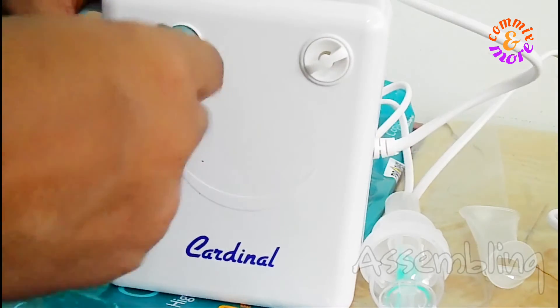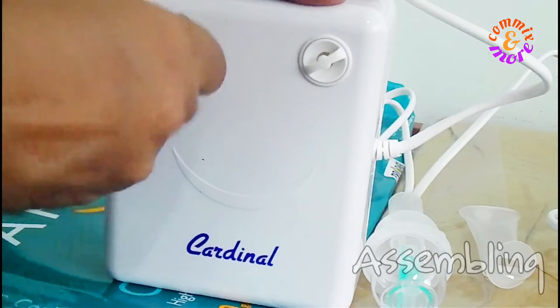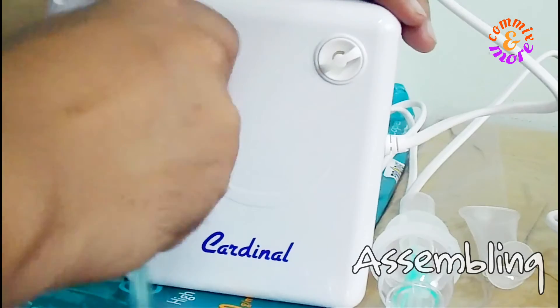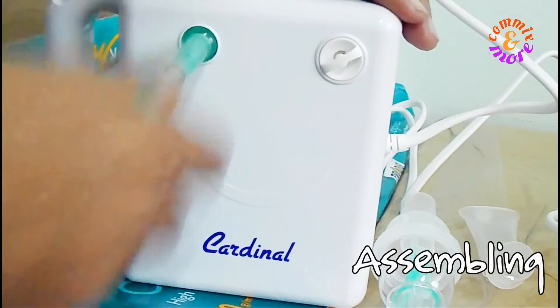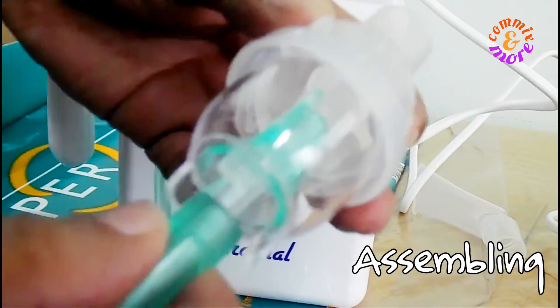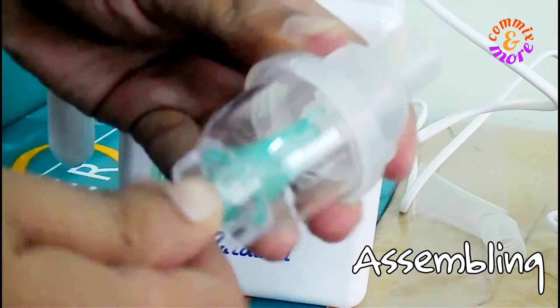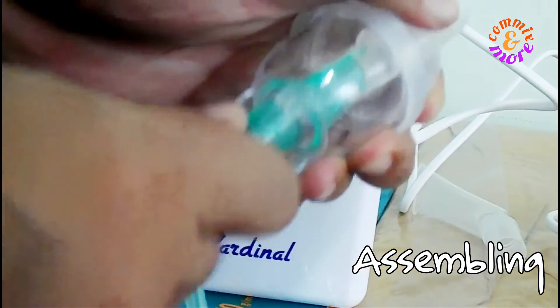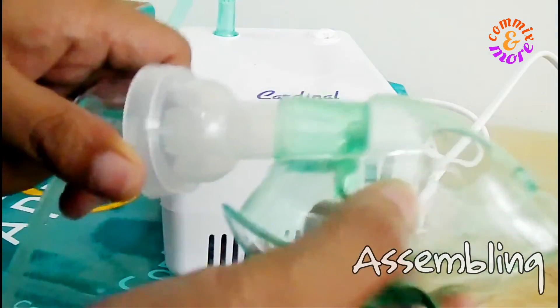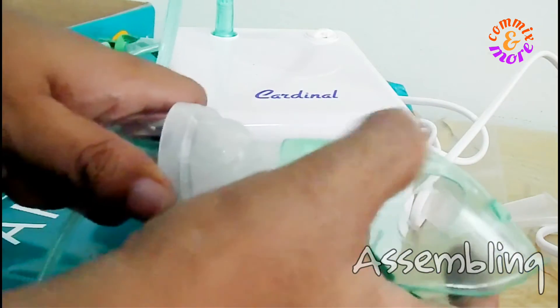Let's talk about the assembly. We put the hose on the main nebulizer unit, then we attach the atomizer, then we attach the tube, and finally the small face mask or the adult face mask.